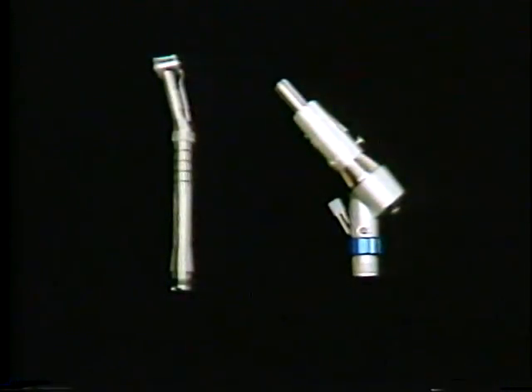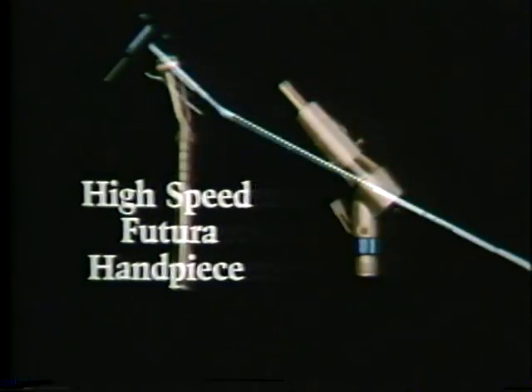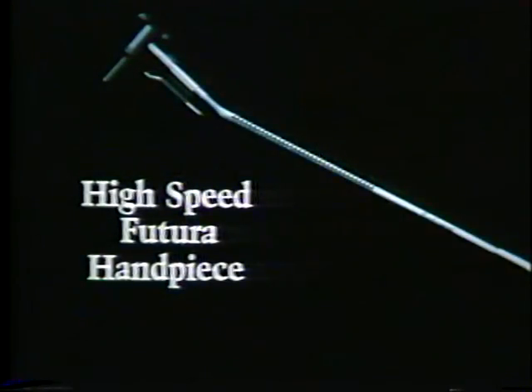The cleaning procedures aren't difficult, especially if you follow the step-by-step directions given on the handout. This program will demonstrate maintenance for the high-speed Futura handpiece and the slow-speed Midwest handpiece. The high-speed Futura handpiece must be cleaned at the end of each work week.